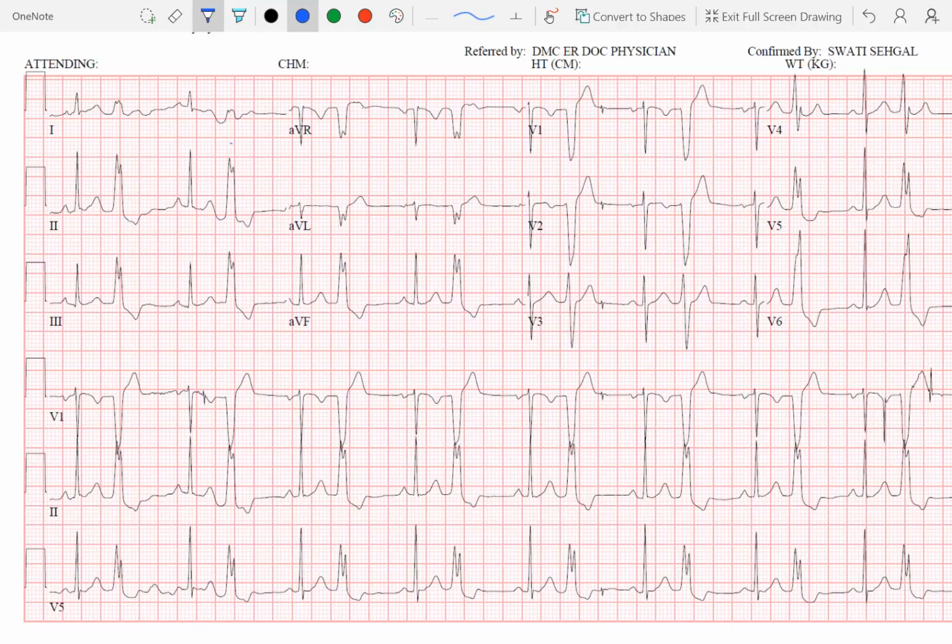Okay. So that's the first thing to note, and you note the PR interval is normal, and the P waves conduct to the ventricle normally with a narrow QRS. Correct. And following that, you have these wide complex beats that seem to follow in a bigeminal pattern. So you have this narrow complex sinus rhythm followed by a narrow complex conducted beat, followed by a wide complex conducted beat, then followed by a sinus narrow complex, then wide complex. So in that setting, you have a bigeminal pattern, and the question is, is this an atrial bigeminy with aberrant conduction versus ventricular bigeminy?